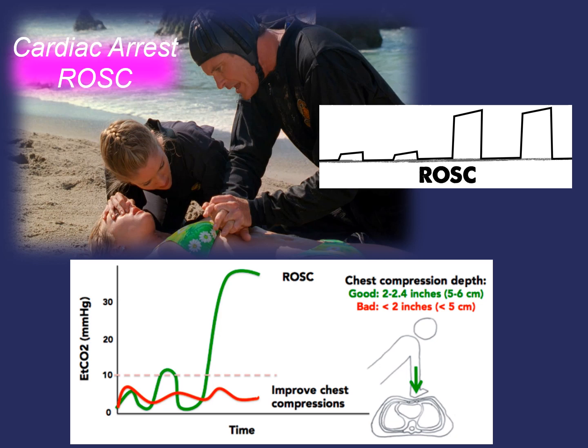So what next? The patient is in ROSC, and these patients are at great risk for re-arresting within the first 10 minutes. There are a few things to keep in mind. First, the initial end-tidal CO2 will be elevated above normal range from CO2 retaining during CPR. So ensure to titrate ventilation rates and tidal volume to try to maintain an end-tidal between 35 and 45.